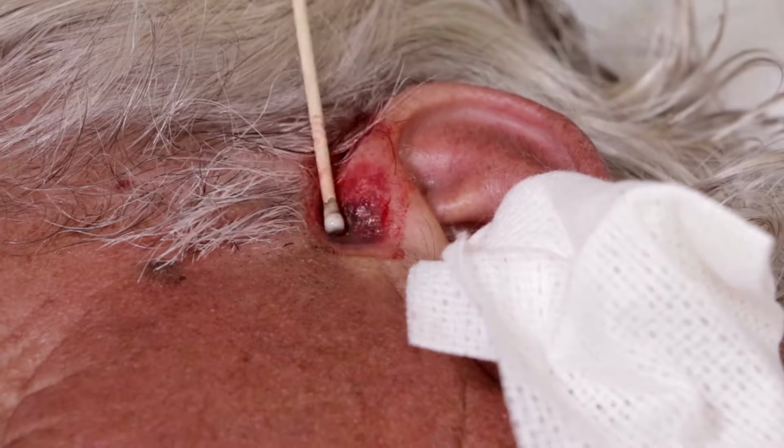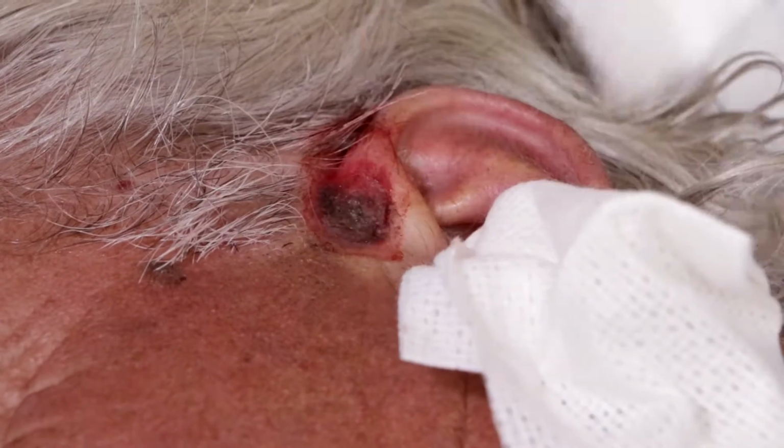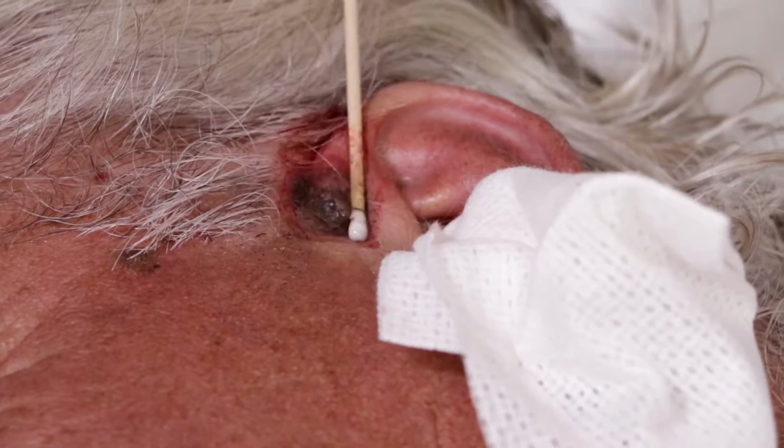We'll use that. Most surgeons will use electrocautery, the little electric current thing where you see the current passing through a little arc, and it smells like burning flesh. We don't use that here. We have one that's called chemical cautery with silver nitrate. We still have to keep an eye on it even after doing this treatment, because it can come back after any treatment. But this is a very effective, simple, relatively inexpensive treatment.